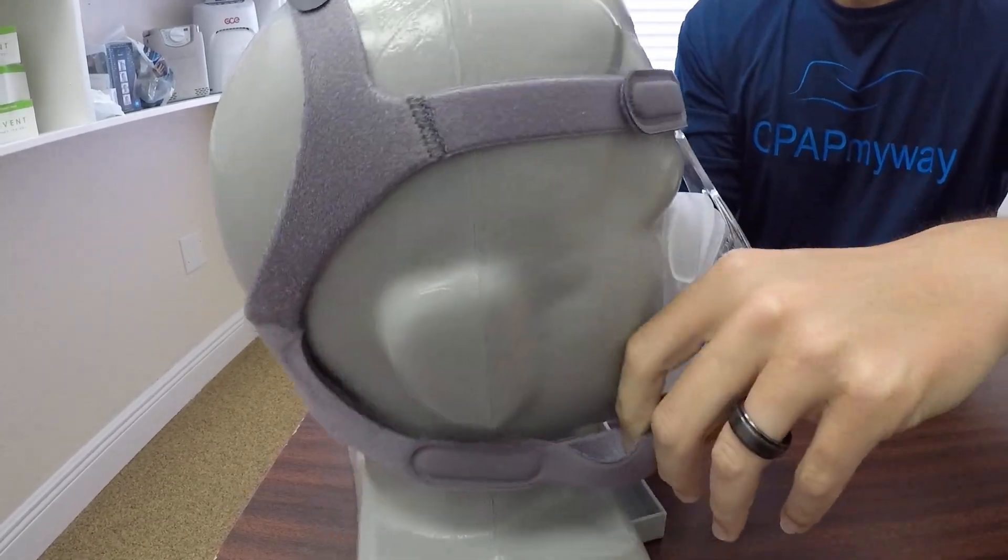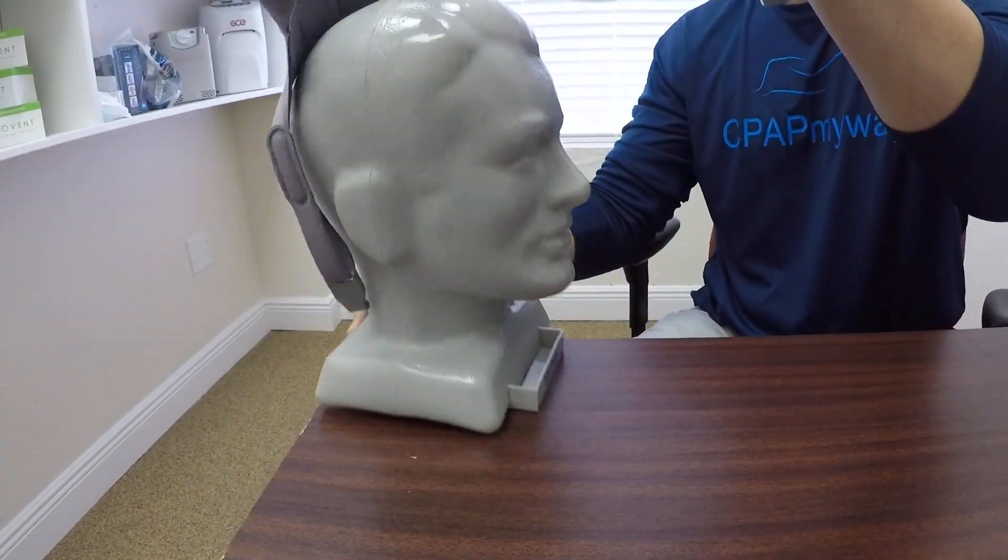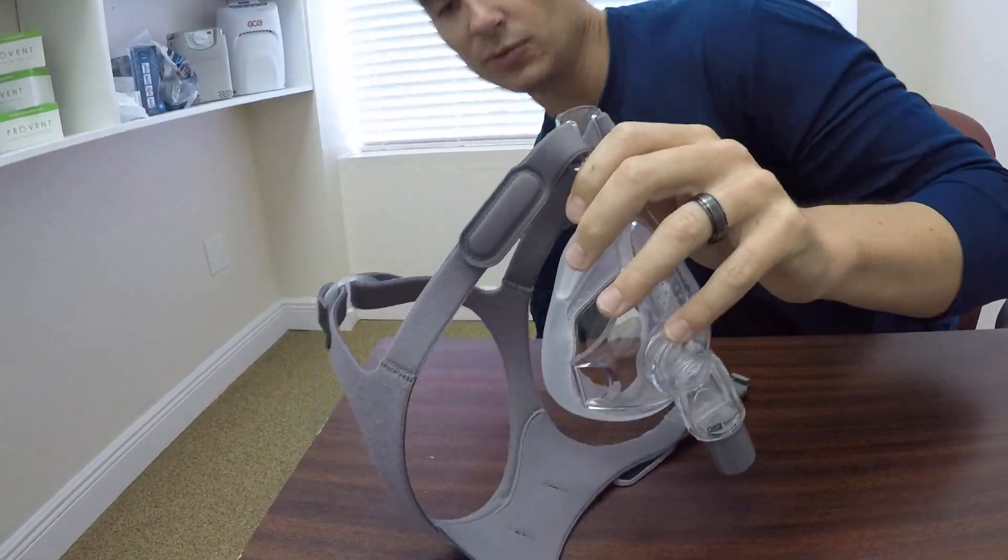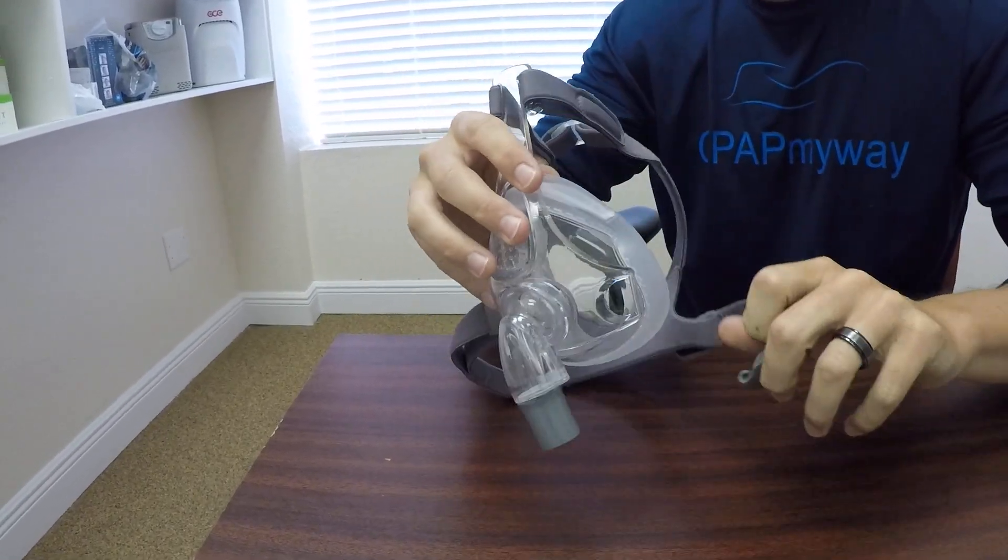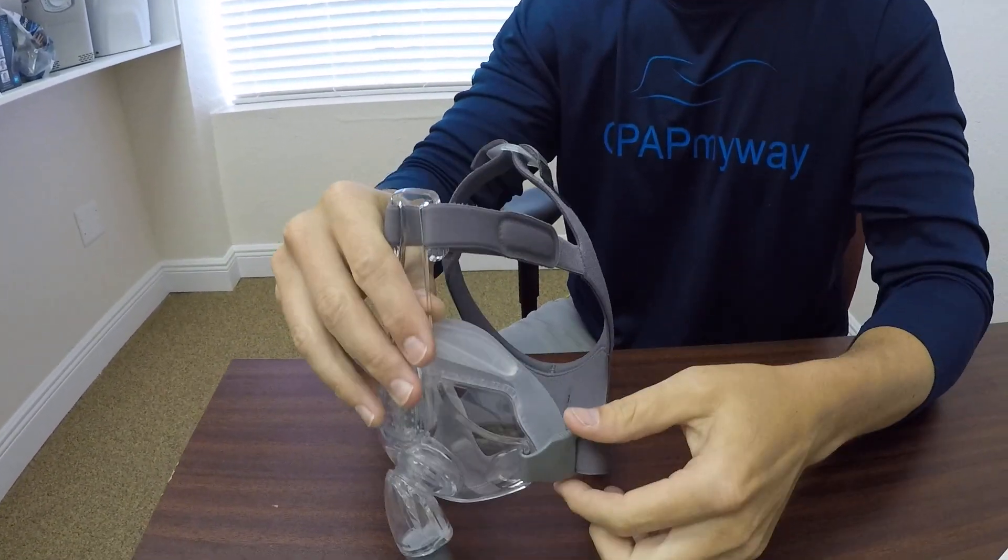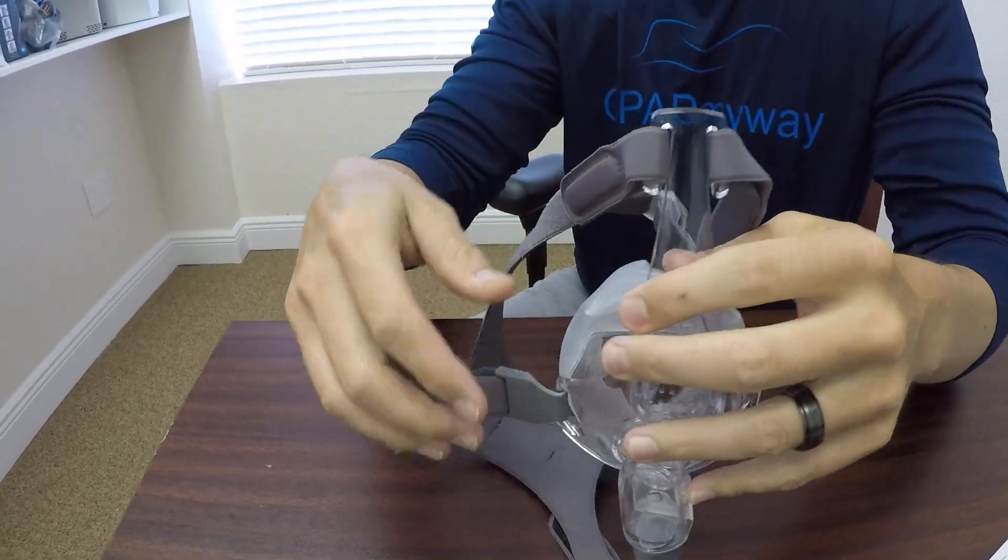Alright, take it off and look at it a little closer here. So as you noticed, I removed the bottom hooks on this. The appropriate way to take it on and off is to remove both bottom hooks by pressing down and slide right off.